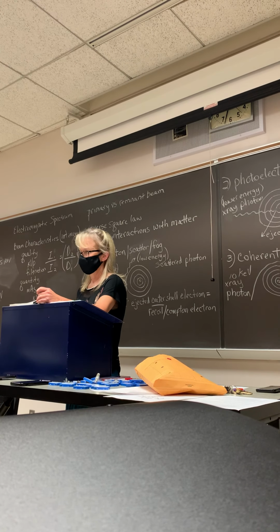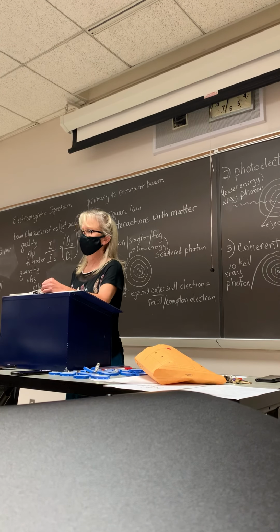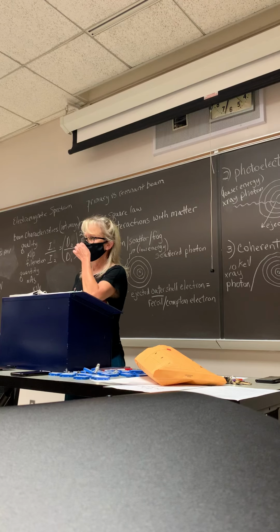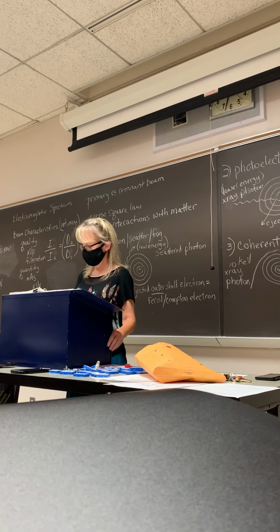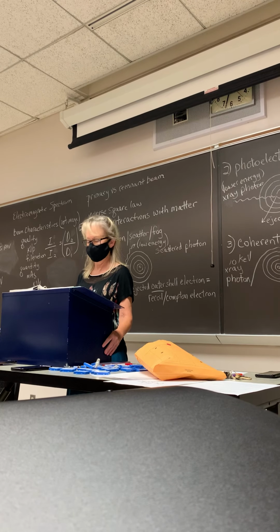You said any tubes above 70 kVp? That operate above 70 kVp, which is pretty much any tube at all. They pretty much all operate above 70 kVp. Must have at least 2.5 millimeters of aluminum equivalent for the filtration.